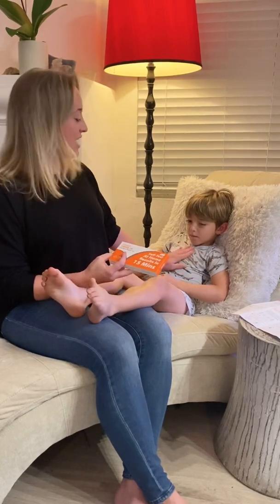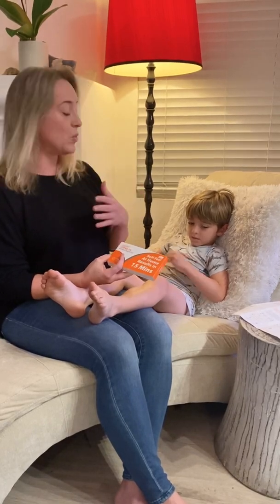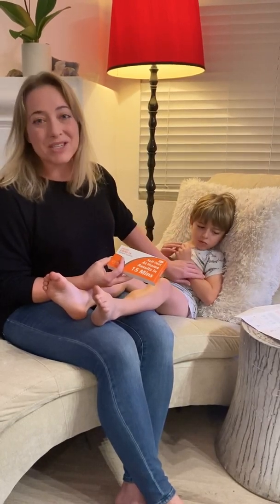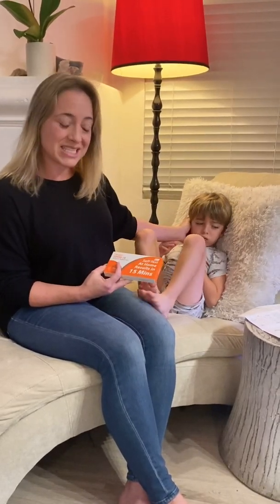I know that I've already been exposed to anything he's been exposed to, so I don't have a mask on. But if you're running the test on someone who you have not been in close exposure to and you want to keep it that way, make sure that you wear a mask and have them wear a mask except during the time that you're actually administering the test.